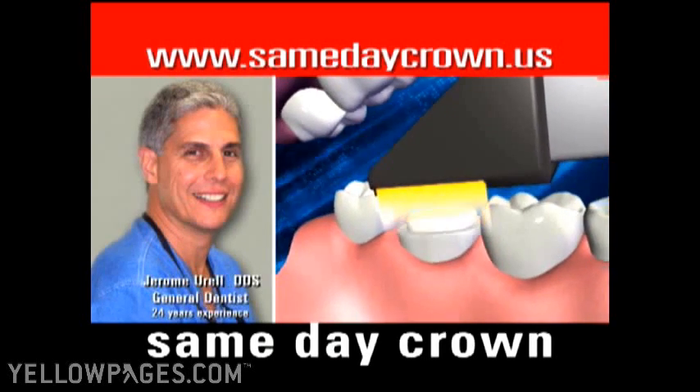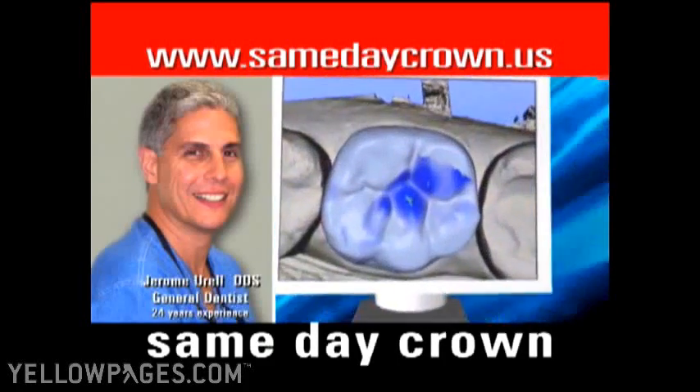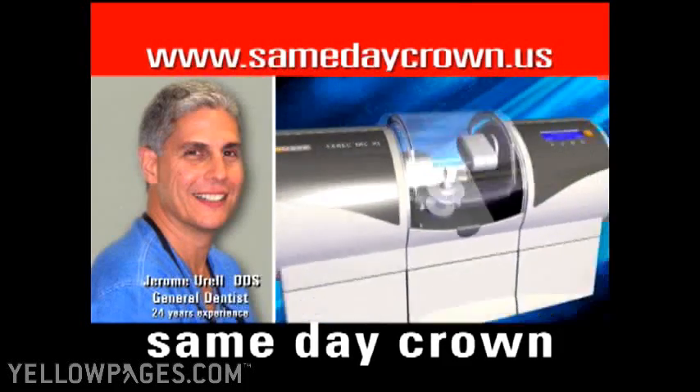First, a digital snapshot of the tooth is taken. Second, the image is transferred to a computer where a three-dimensional model of the tooth is designed. Last, the model of the tooth is sent to a milling machine where your crown is made.